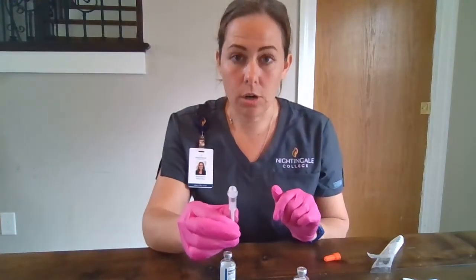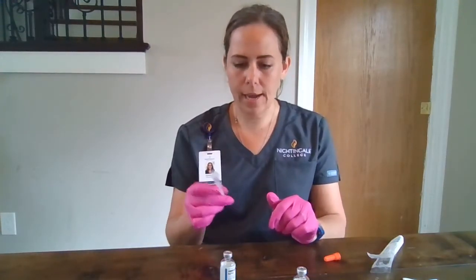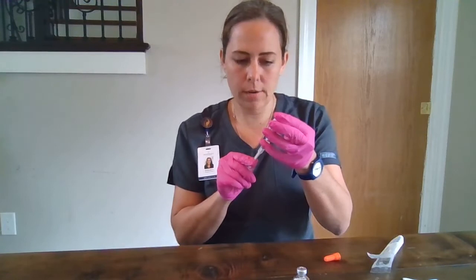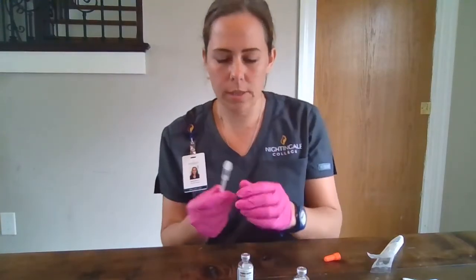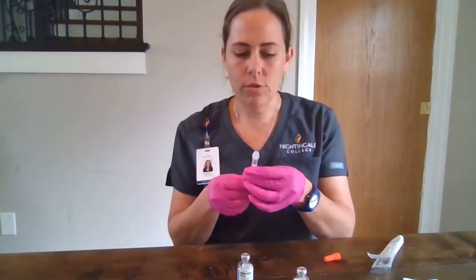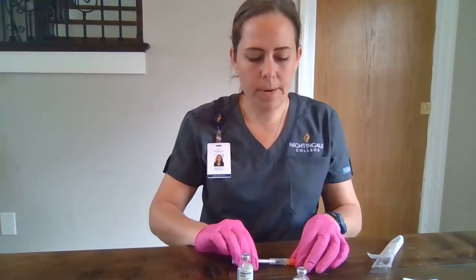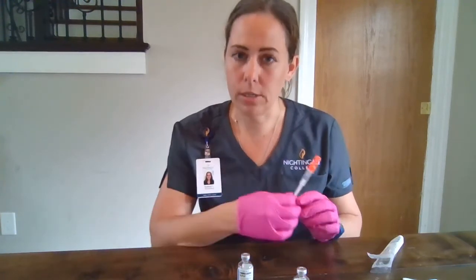We're going to verify our drug calculations — our 12 units should be total volume — and verify all of that in the MAR again. Next, we will withdraw our NPH, making sure not to push any of the regular insulin back into that vial, and be extra cautious not to overdraw. If we do, we will start back over from the beginning. Verify that we have 12 units in there and verify that in our MAR again. There's our 12 units. If we have prepared this away from our patient, we will recap it very carefully, label our syringe with our medications and dose, and go administer it to our patient.